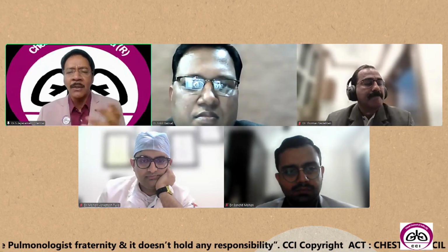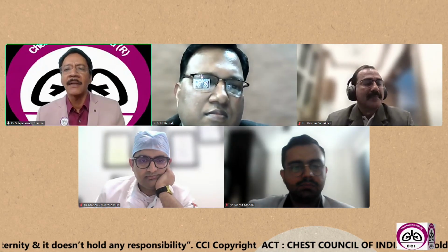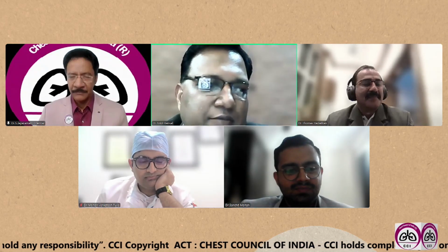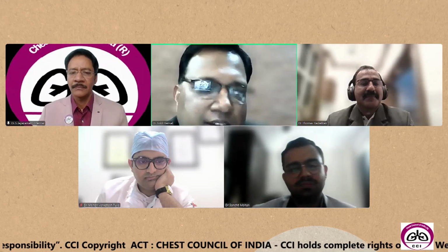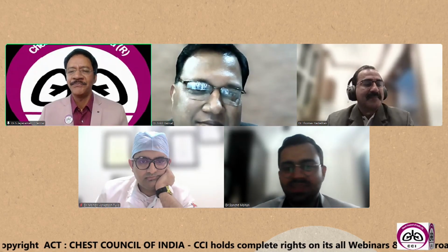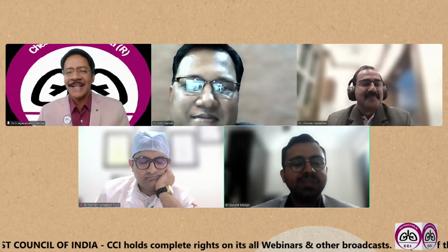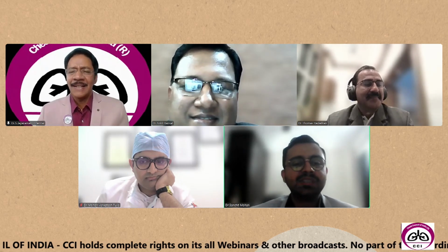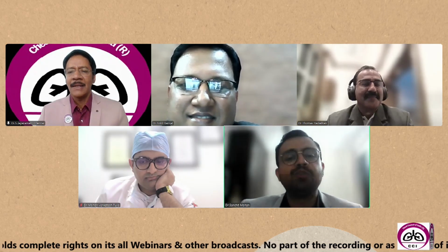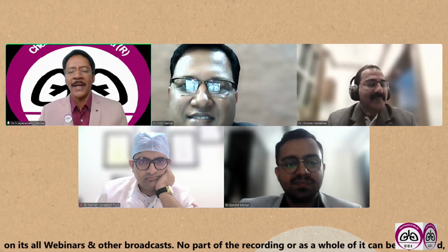So I am requesting all the panelists to give one-line take-home messages, to start with Dr. Ankit. So, sir, vessels are the compass, lymph nodes are the destination, so never navigate without your compass. Fine. Dr. Sanjit. I second Ankit sir. You have to be sure about the vessels and not hurry up biopsying or sampling the node. You should screen for the node, and when you are confident enough, then go ahead and sample the nodes. Okay, fine, fantastic.